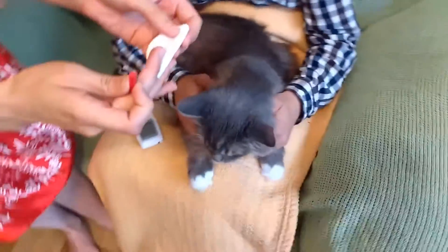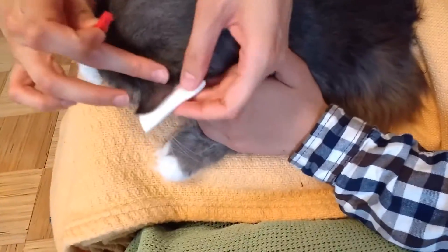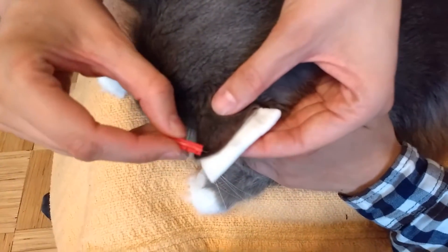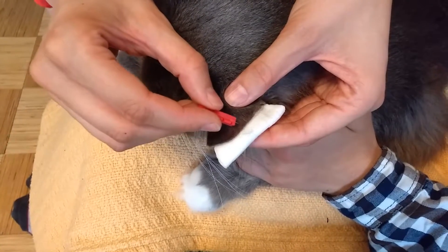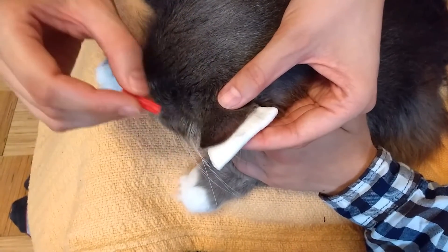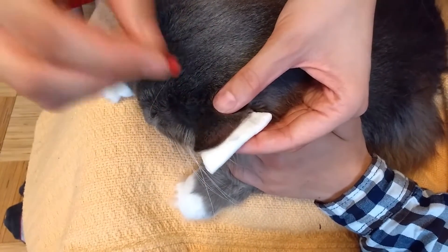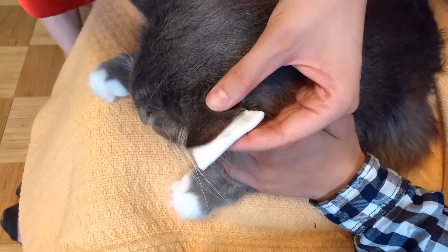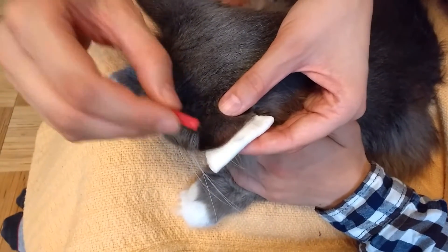Then you're gonna fold your cotton pad. There's a blood vessel in a cat's ear — it's about one to two millimeters from the edge of the ear. And it's very important not to poke the blood vessel. If you do, don't worry, but don't do it every time. Try not to poke the blood vessel.